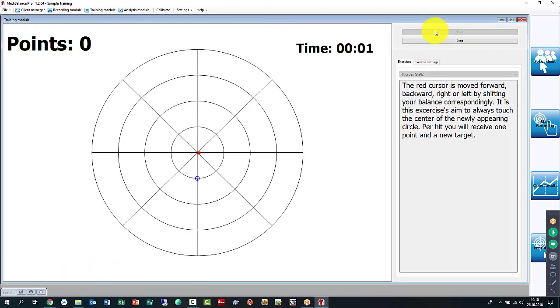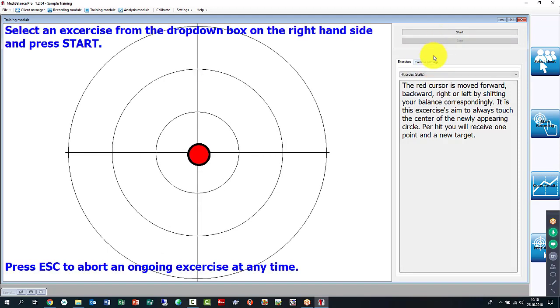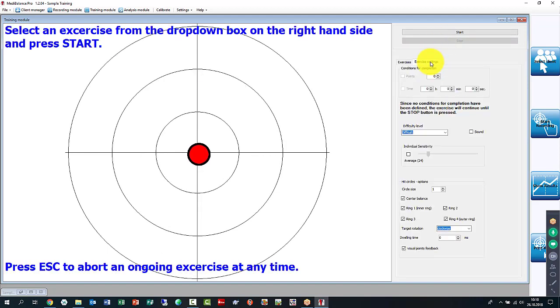Now my circle is very, very small, and hitting that is actually quite challenging, but doable. So that is basically how you can do that. It's a very straightforward training process. If I find that I need to adjust this more, I can do so on here. All the parameters are available, and I can always set a condition when the training session for this particular game is over.